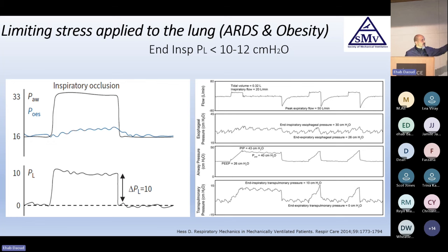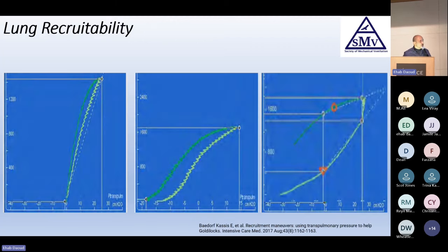So again, this is the stress, what the pressure the lung is seeing, not the chest wall or the diaphragm. How can it help me also too? Again, we always talk about recruitability. Is that lung recruitable? If I do PEEP and do prone and recruitment maneuver, is my lung going to improve and open and be good? Or the PEEP is not doing anything if I just jacked it up? Or what it will be doing is over distension of some good alveoli and worsening hemodynamics.